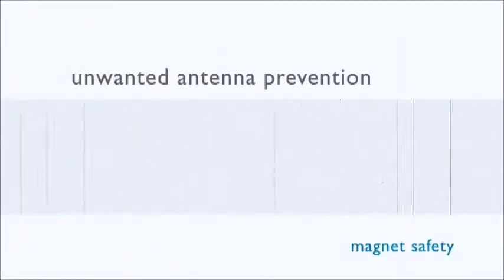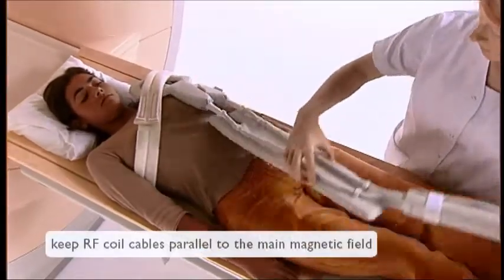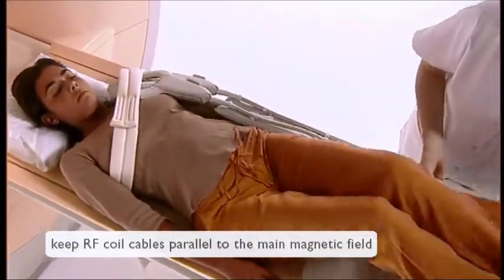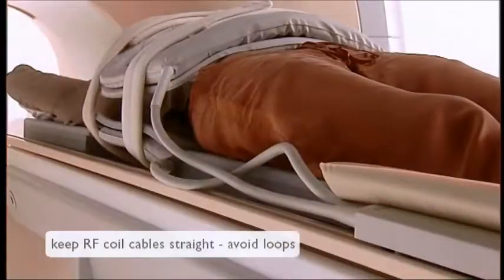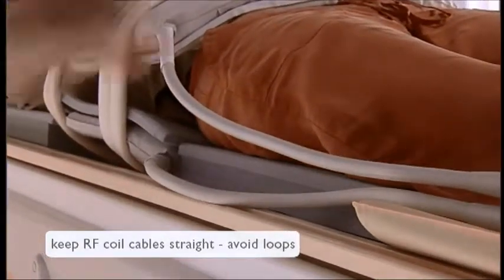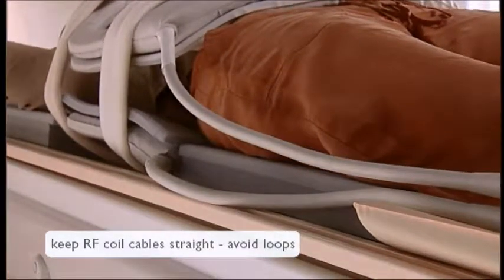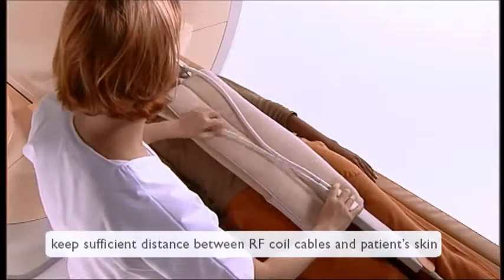Unwanted antenna prevention. Cables should be positioned parallel to the main axis of the patient's support. Loops must be avoided, and cables must not cross each other or other electrically conductive objects. There should be a layer of insulation between the patient and the coils.